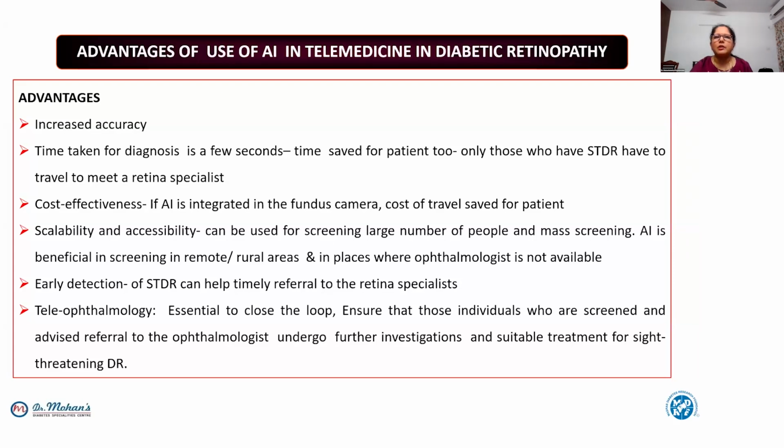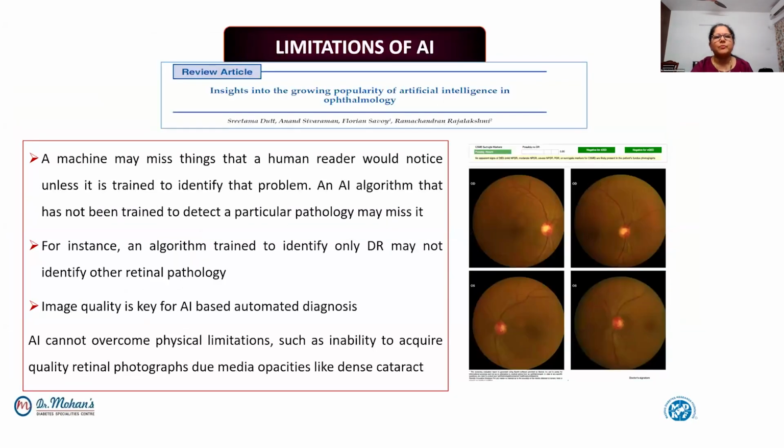But what we all need to remember in telemedicine is that very often there are many patients who are screened using different kinds of cameras, whether it's ultra wide field or standard camera. What is important is to close the loop and ensure that those who are advised referral to the ophthalmologist actually go and meet the ophthalmologist for further management.